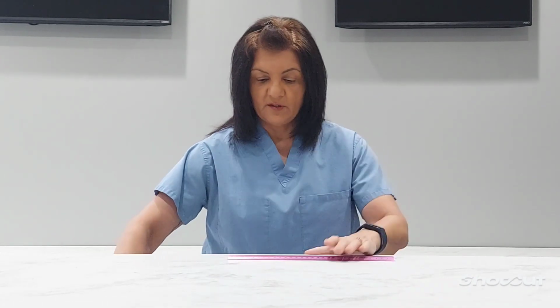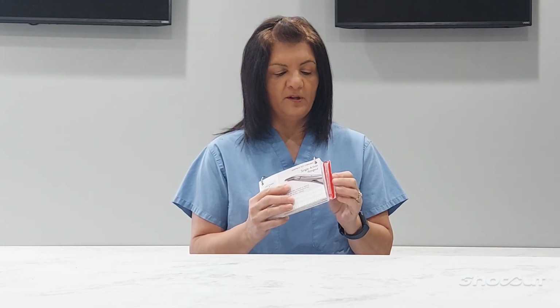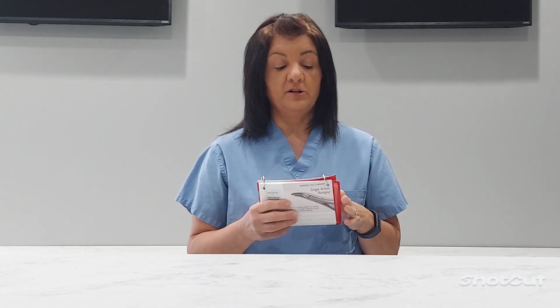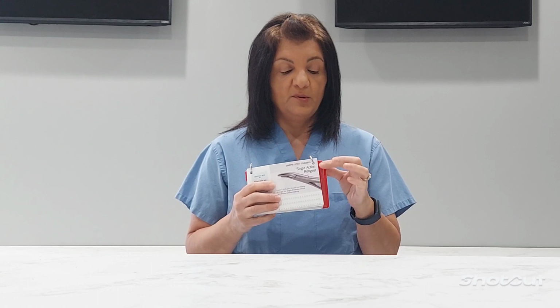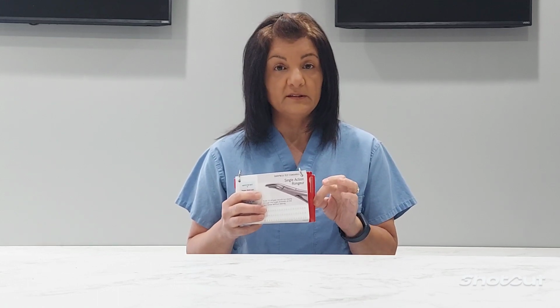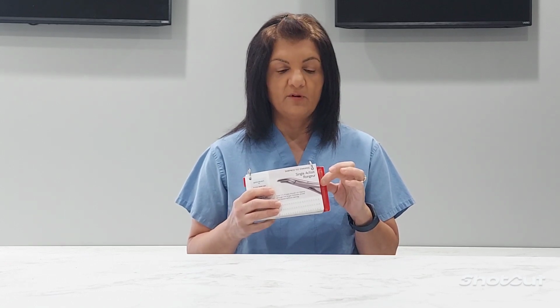So moving on, we have some other items. Some of you may be familiar with this testing booklet. I'm not here promoting a particular brand of testing booklet. I'm just promoting that you do the testing on these instruments. It's very important to the health and safety of our patients. So this particular book has a plastic dowel rod on the side. This is not a glue stick, as some people have thought it was. This is actually a plastic testing rod.